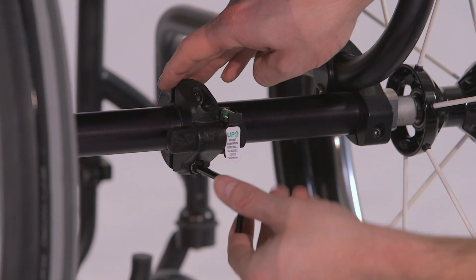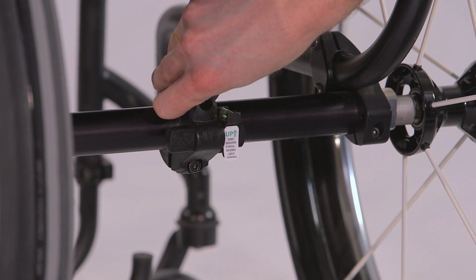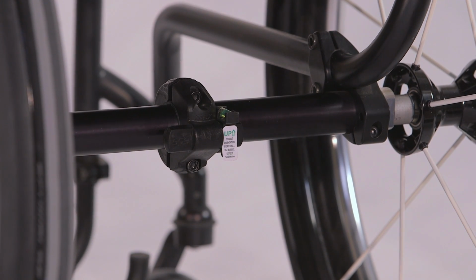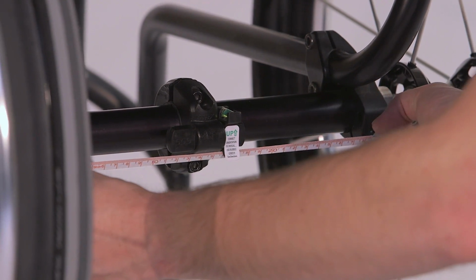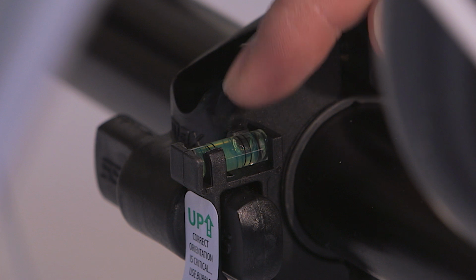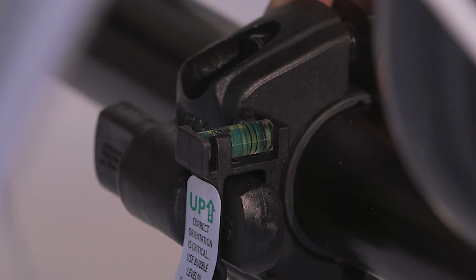But don't tighten them all the way down, as the clamp position and orientation are critical. For this, first measure and adjust to make sure the clamp is in the middle of the axle. Next, looking at the bubble level provided with the clamp, orient the clamp so that it is perfectly perpendicular to the ground.